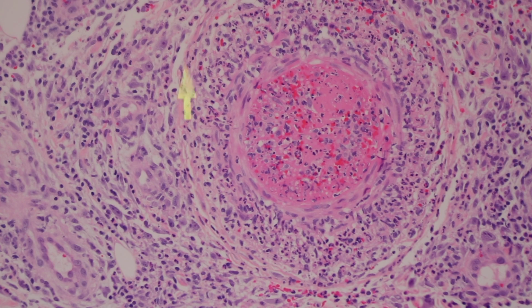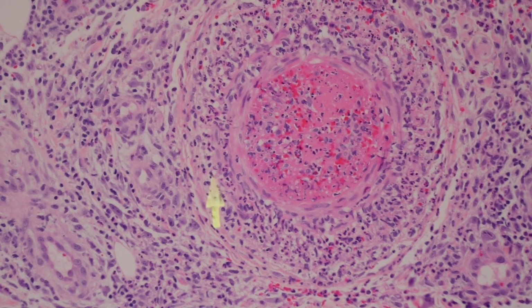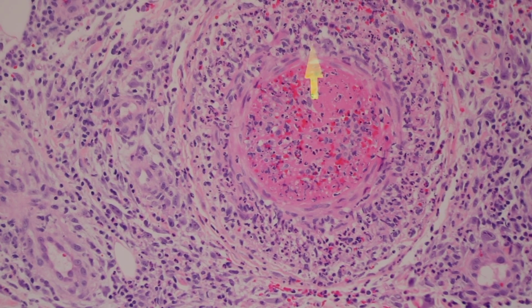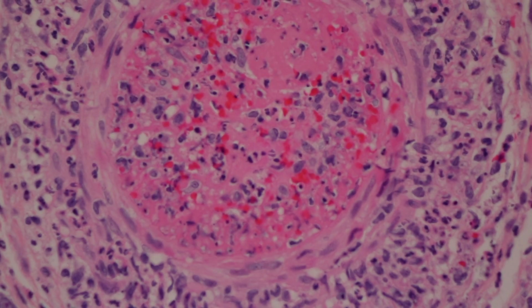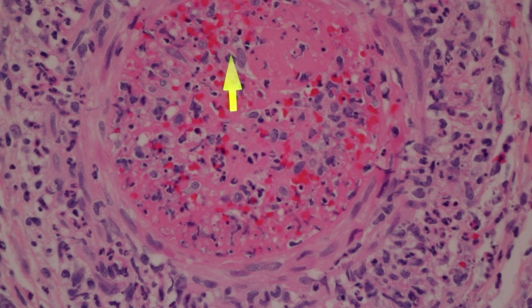So you can see a little ring of muscle still around on the outside. You can see a little ring of the muscle here, and then in the middle, tons of neutrophils chewing up that vessel wall. The whole lumen is packed full of fibrin and a little bit of red cells and probably a few endothelial cells that are trying to recanalize and repair the vessel, and neutrophils as well.